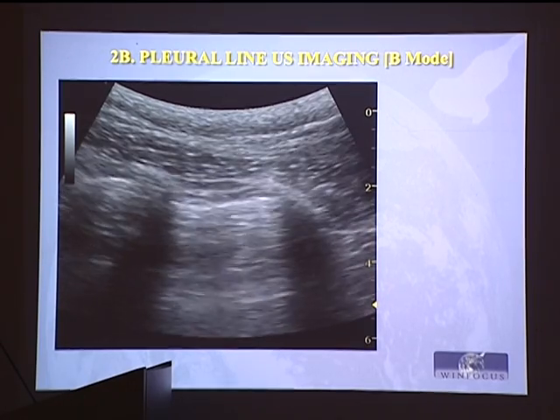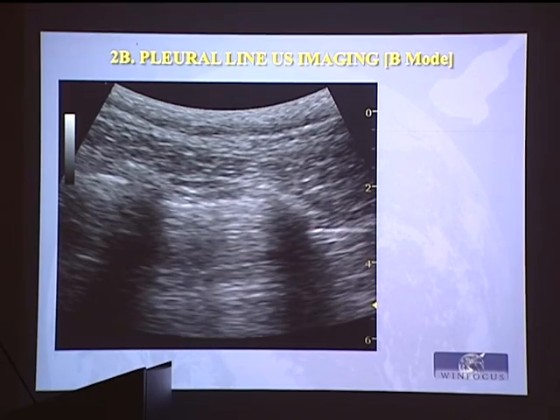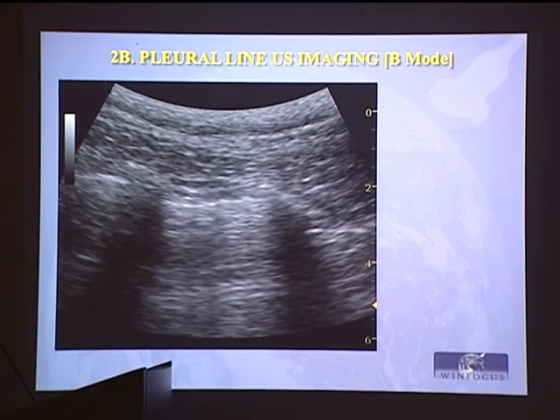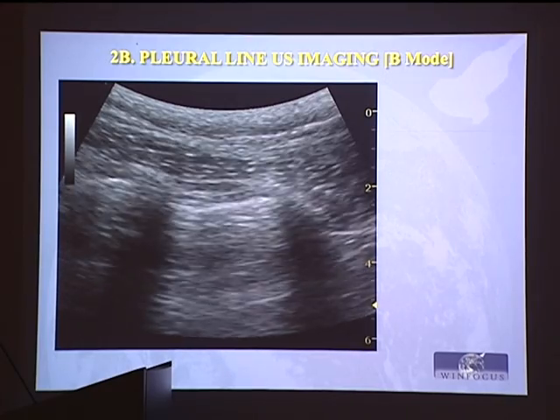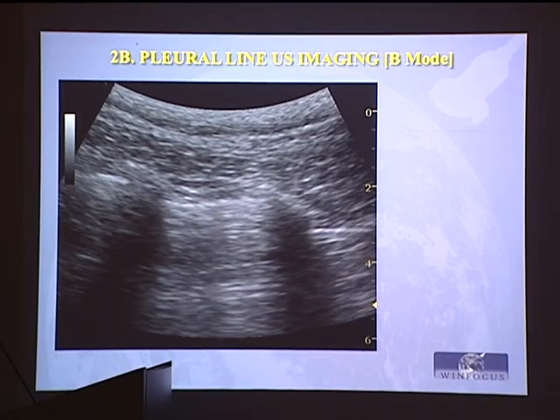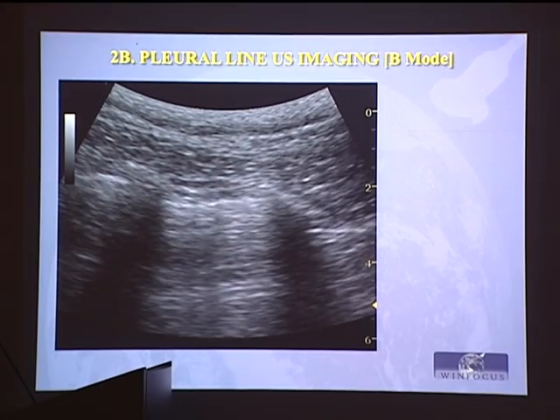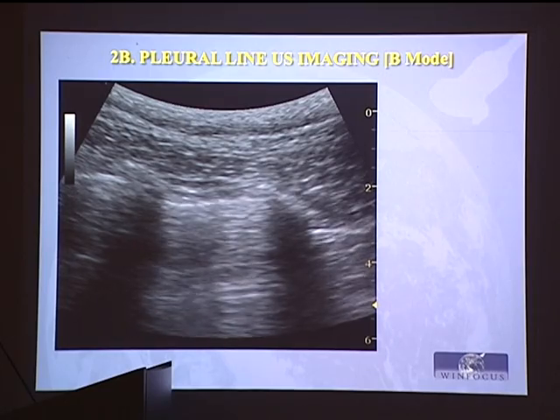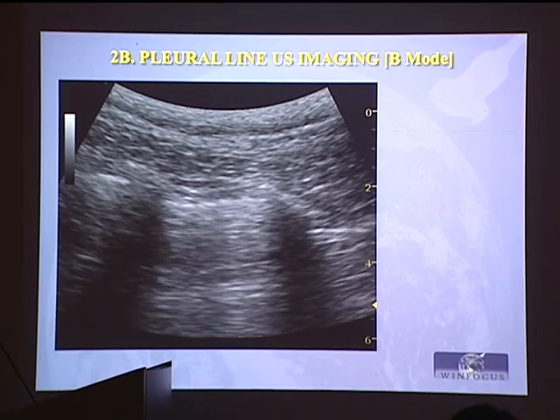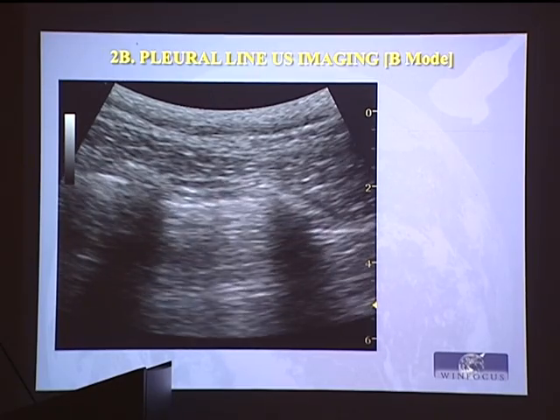But the lung is mobile or immobile? Immobile. And then probably is not ventilated properly. Okay? So lung sliding, as we saw before, means not collapsed by free air, not collapsed by free fluid, and mobile lung, probably ventilated. Lung pulse, again, no free air, no free fluid in this image, but immobile lung. So here could be, for example, right lung intubation. You will have a right sliding present and absence of the lung sliding in the left side with the lung pulse, for example. But in both sides, no pneumothorax.